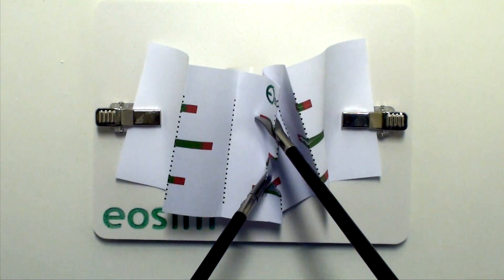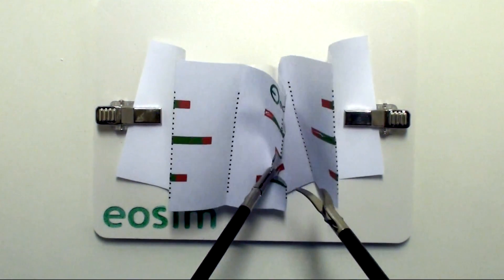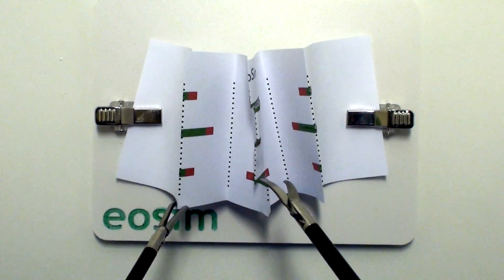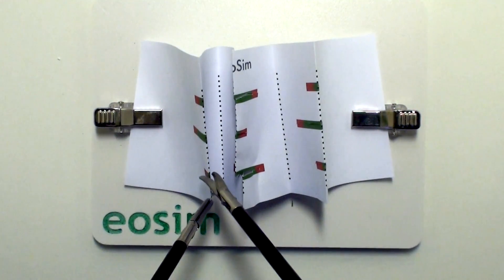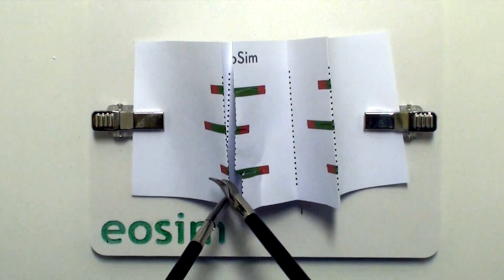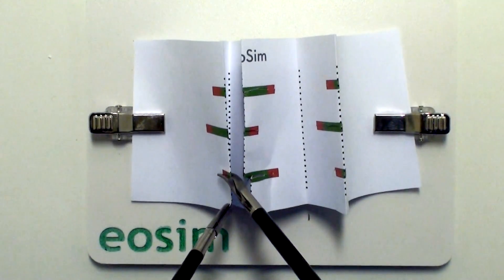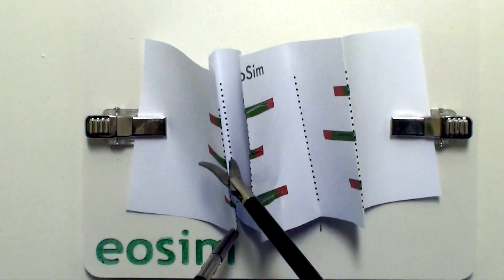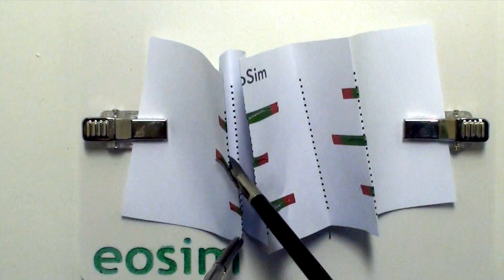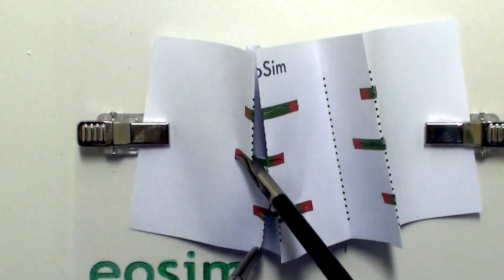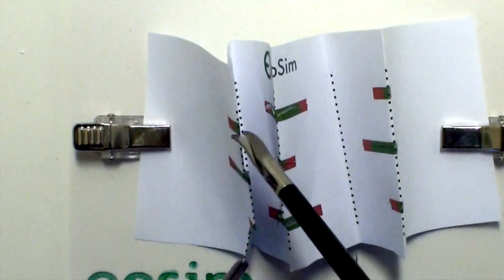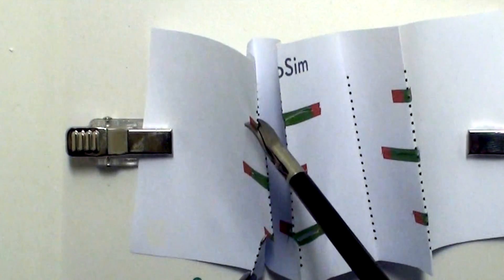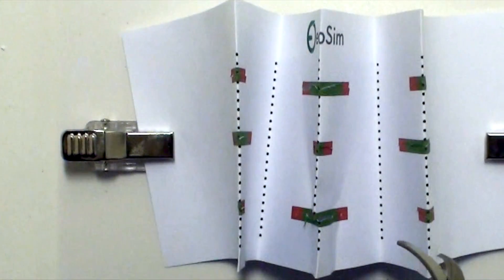As you progress on, you can see that in the deeper areas you may have to make more than one cut. On the left hand leaflet here, we're having to move the leaflet across, so again we're lining up the scissors with the bit of paper and cutting through the green area and into the red, but not past it and not too short. Again, the deeper line there requires two cuts.